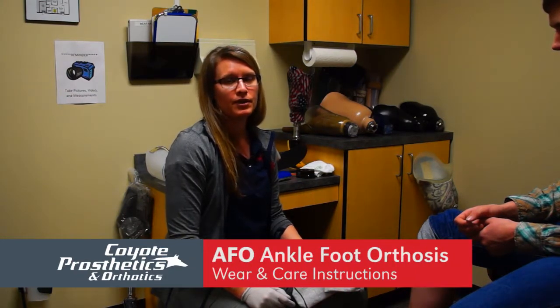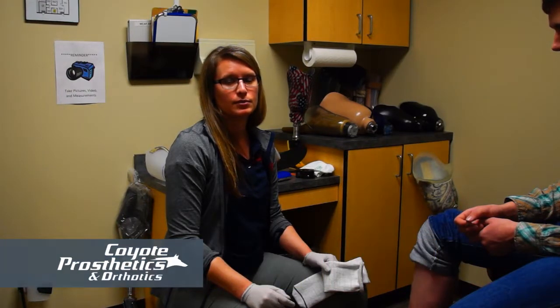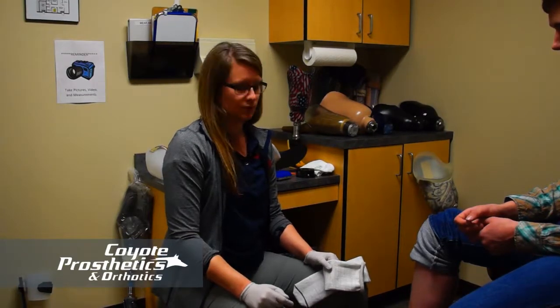I'm Anna Larson from Coyote Prosthetics and Orthotics. Today I'm going to go over the wear and care instructions for an AFO. There are lots of different kinds of AFOs and I'll just briefly go over a few, so you want to follow the specific directions that you're given. These are just general guidelines.